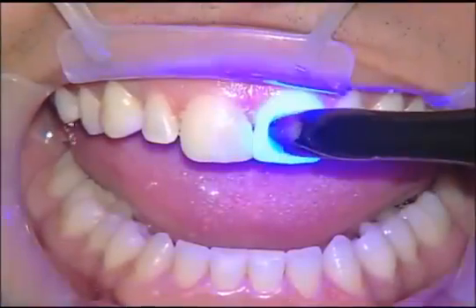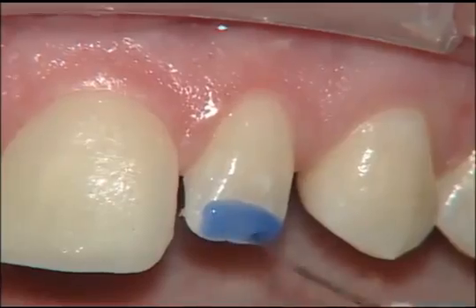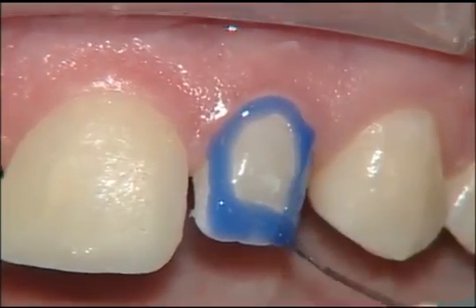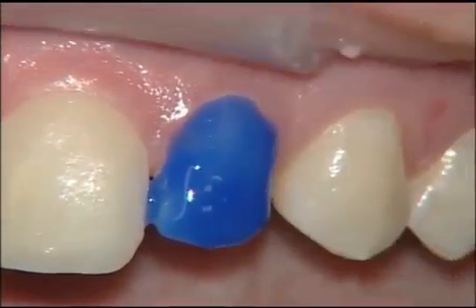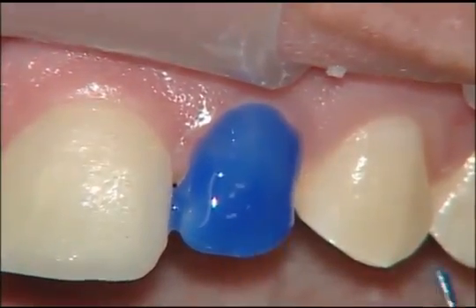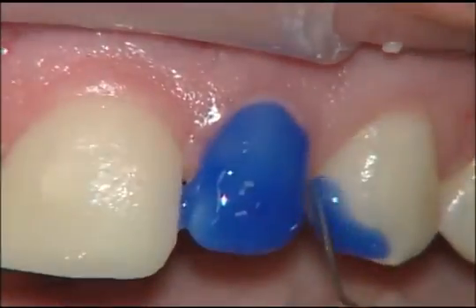Again, the reason we do the two central incisors first is because they're very critical to the outcome of the case. And when you're trying to seat a bunch of veneers together, if you do have contact issues, it makes it difficult to deal with because everything's kind of a moving target. So when I do these types of cases, we'll put the central incisors on first, and then we'll go ahead and place the rest of the veneers. And if we have contact problems, then we'll just kind of make it up as we work our way back.